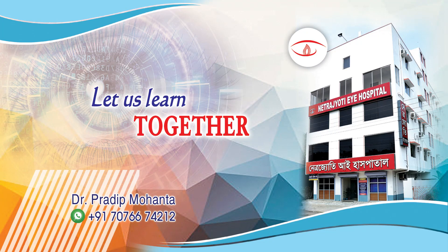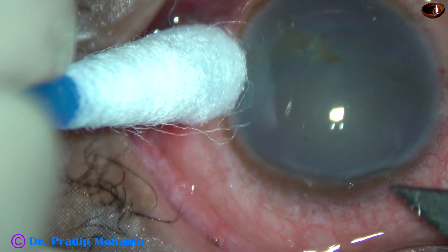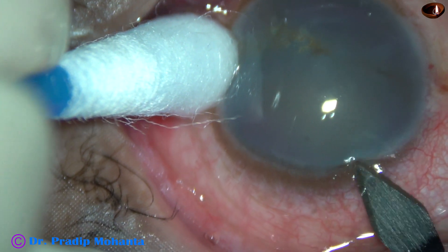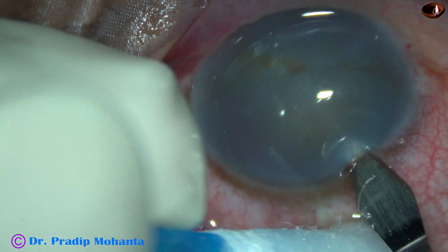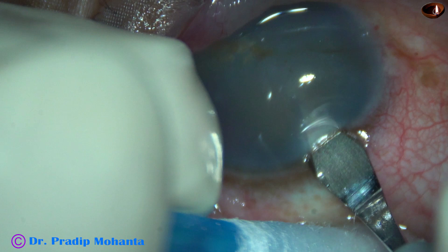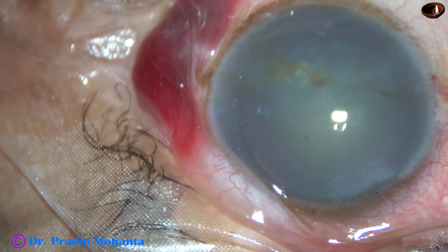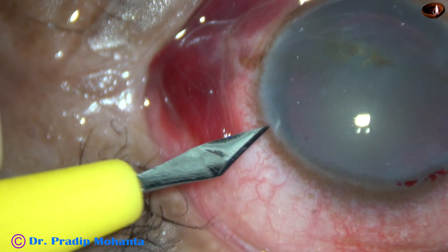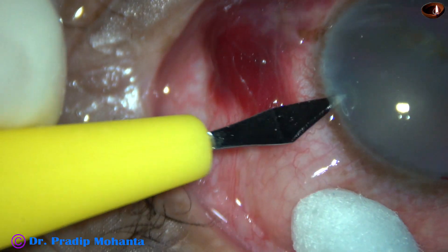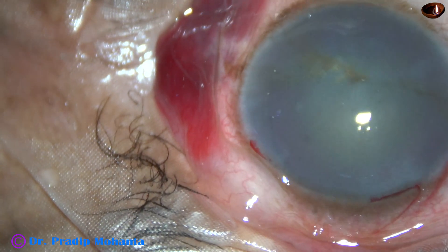Friends, welcome to my workplace at Ranaghat, West Bengal, India. This is a cataract with a very hazy cornea. Slit lamp examination doesn't show corneal edema, but the corneal epithelium and anterior stroma is very hazy, almost opaque. I have taken up this case for surgery. Let us see the surgical steps.